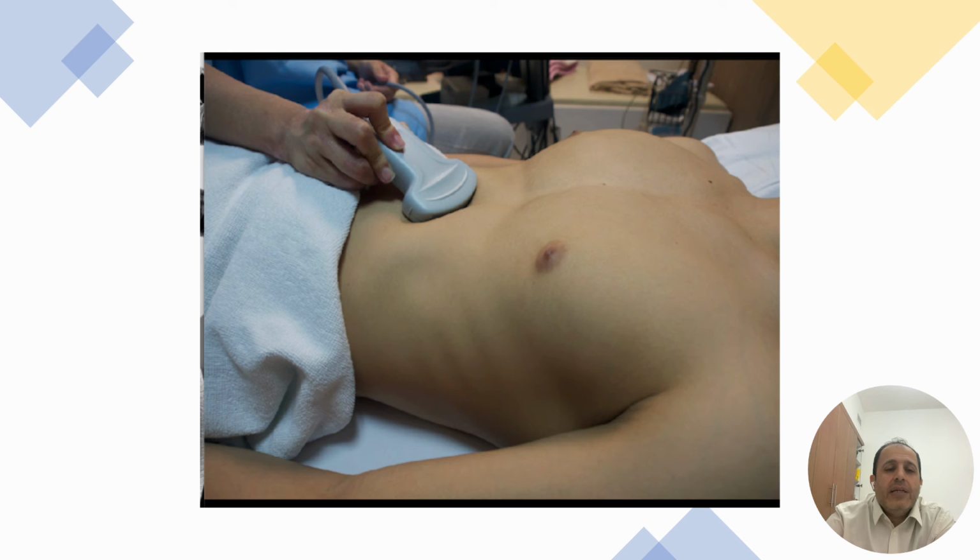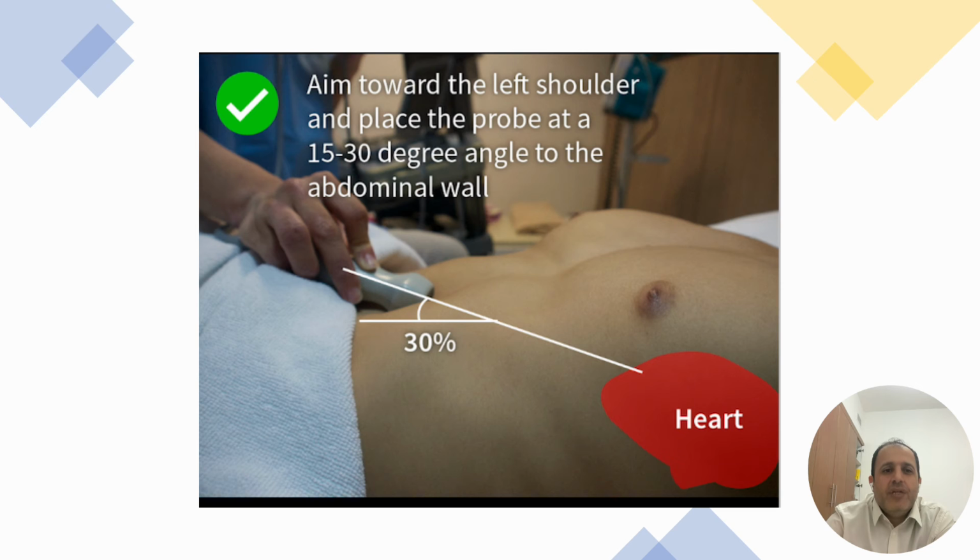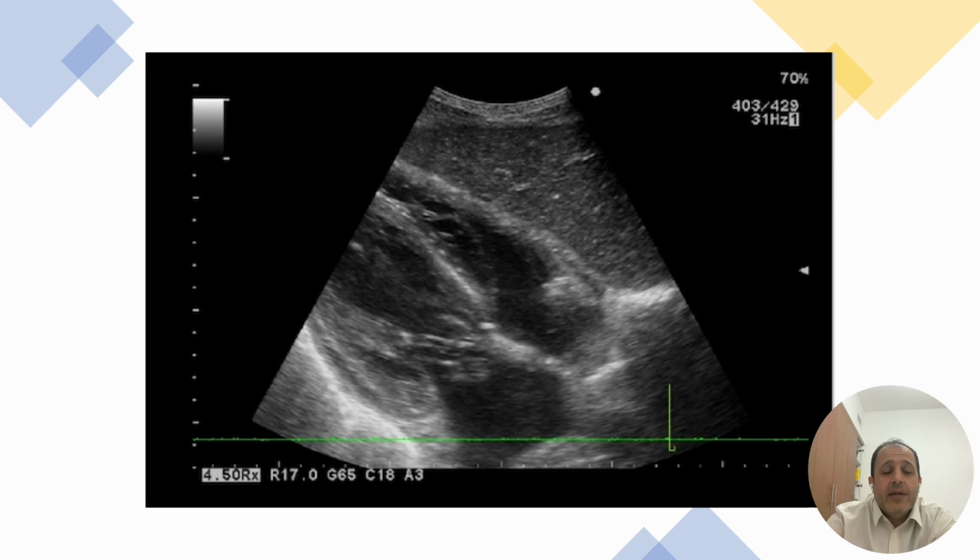You can hold the ultrasound transducer such as this one, like a pen, should not keep it 90 degrees over the epigastrium of the patient, and should keep it at 15 to 30 degree angle to the abdominal wall. The best approach is to find the liver firstly, the left lobe of the liver. And you can use the liver window to find the heart, and very easily then we can find it, as here is the liver, and then we can find the heart.